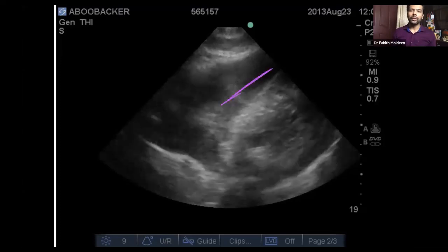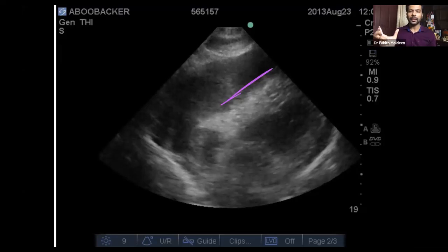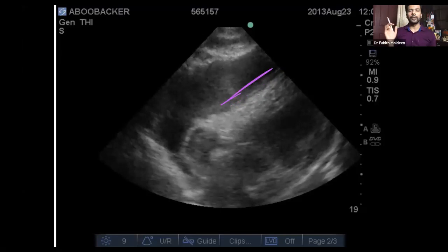The cause is there. You need to do something for this patient, right? The pericardiocentesis, and the patient may survive because the heart is trying to beat but not able to pump. Okay, because you can see that there is a lot of fluid there compressing the heart.